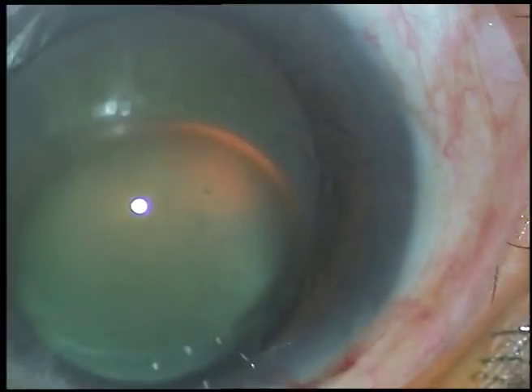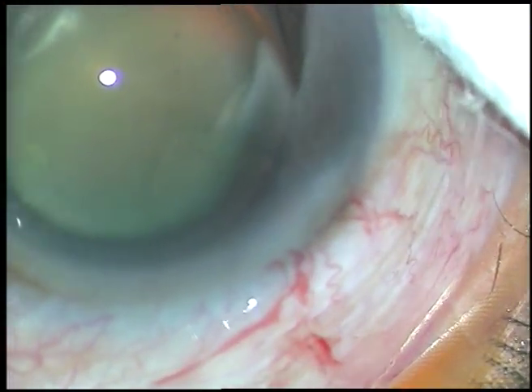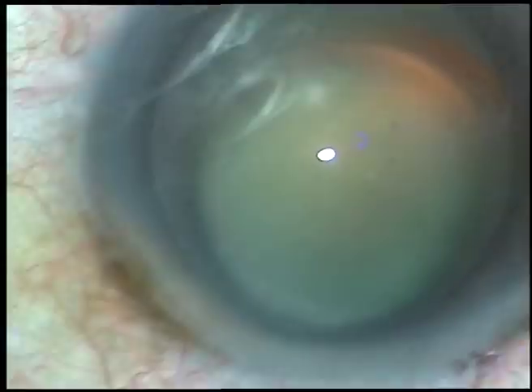Let us watch the full surgery. By this time, the main incision and two side ports on either side of the main incision have been made. And now, I am going to do capsulorexis.